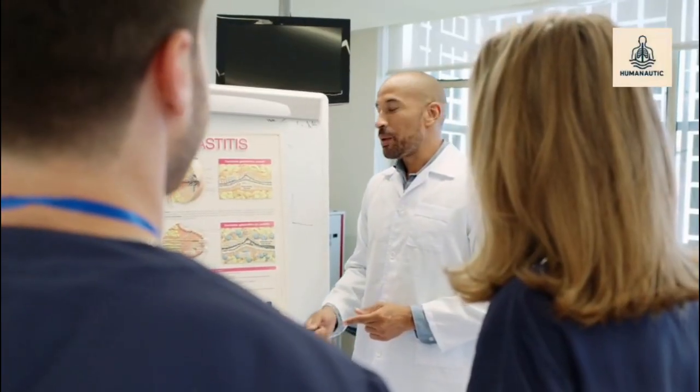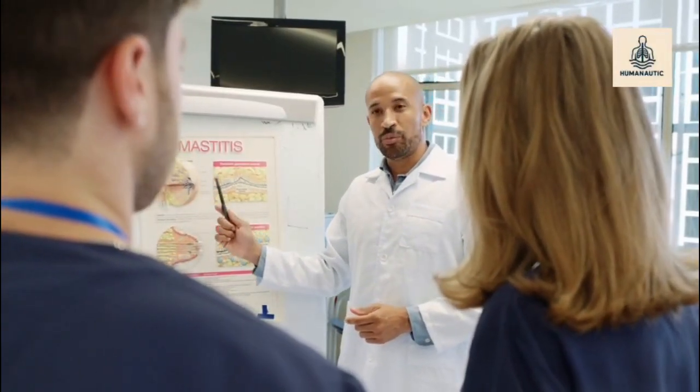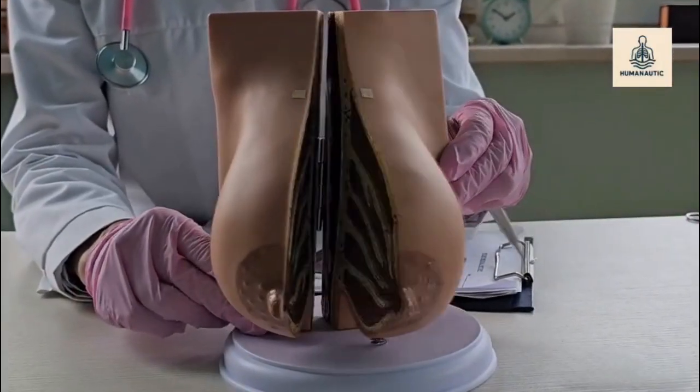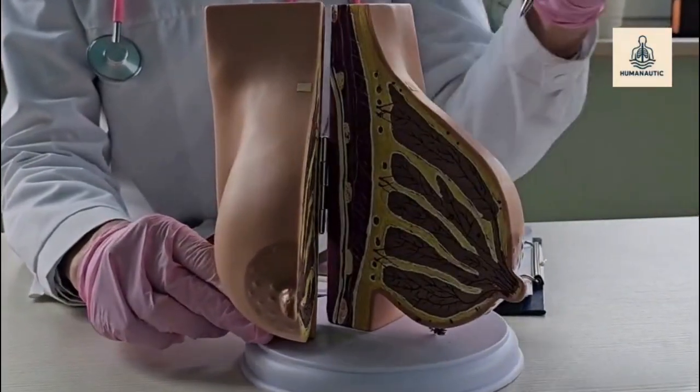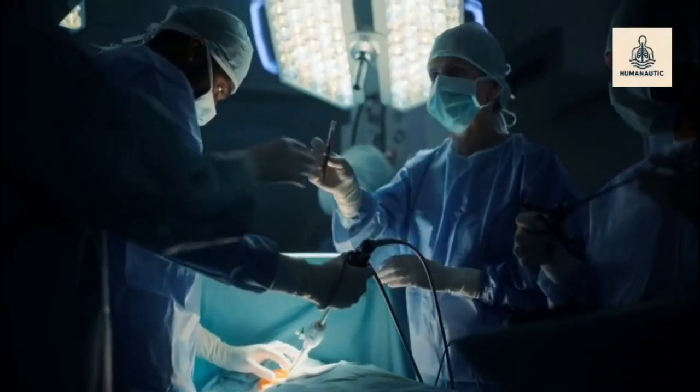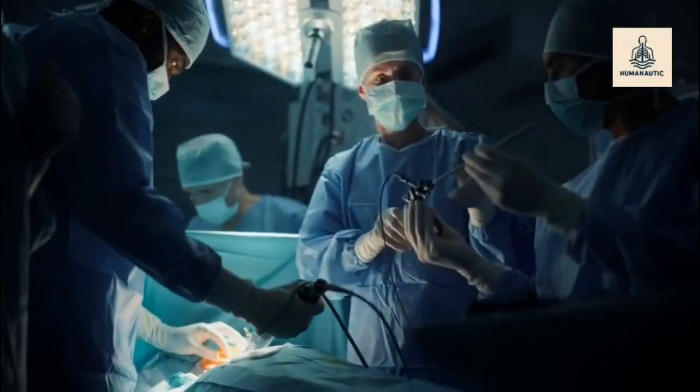Humanauts, have you ever wondered how surgeons perform a mastectomy? A mastectomy is a major surgical procedure in which breast tissue is removed, most commonly as part of breast cancer treatment. Today, let's take a look inside the operating room and walk through the procedure step by step.